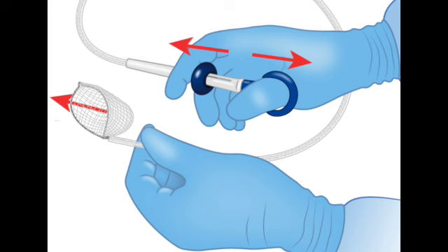Kind of. And then this is critical. You close the net back into the sheath, capturing the polyp inside, and then you withdraw the whole thing, sometimes along with the endoscope itself. Requires some serious dexterity, I bet.